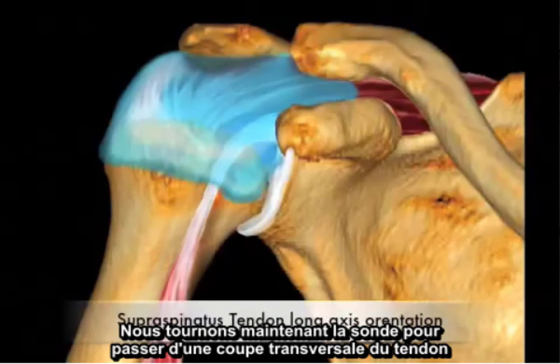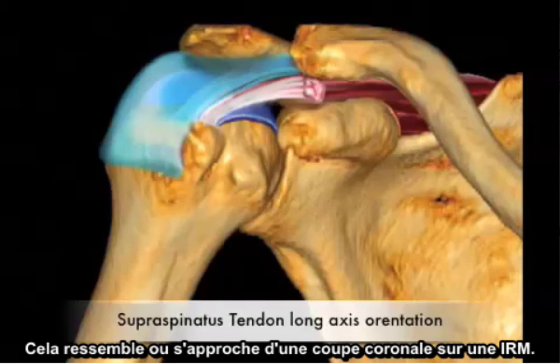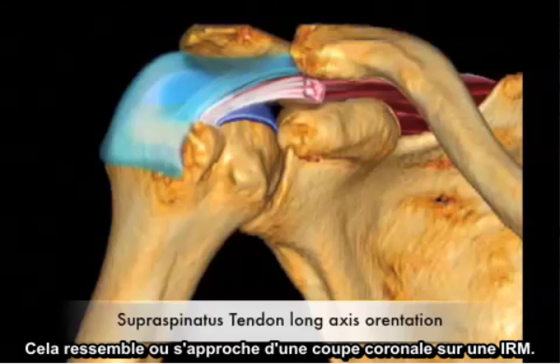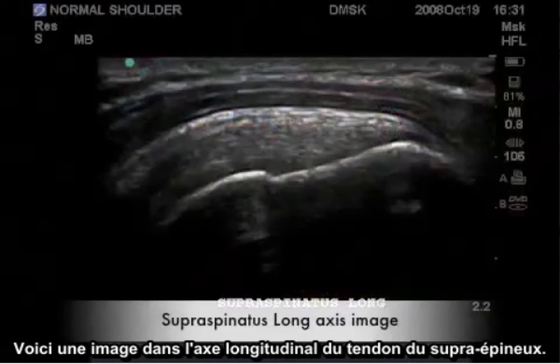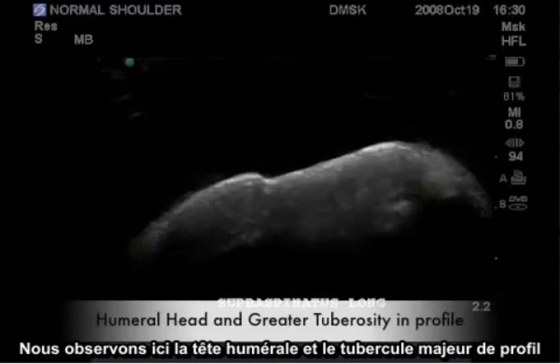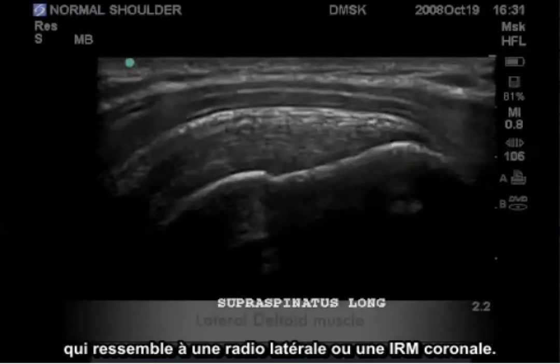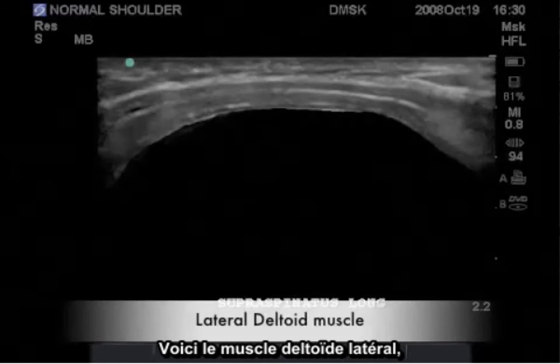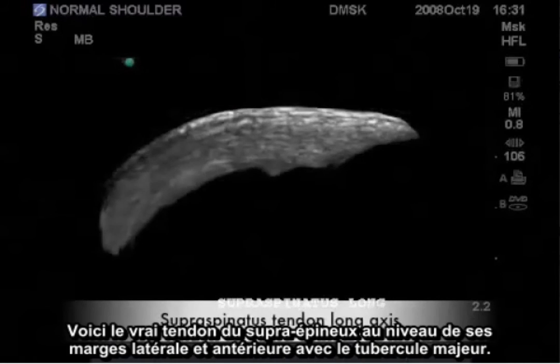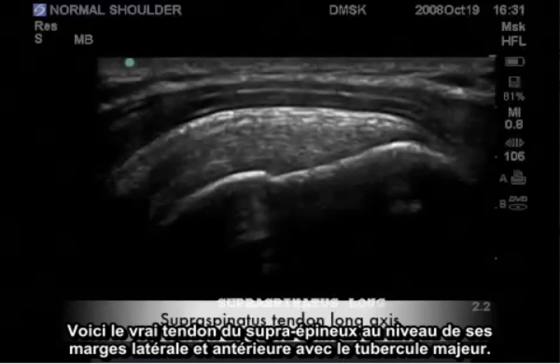We now turn the probe from a transverse slice of the tendon to a longitudinal slice of the tendon, which is similar or comparative to a coronal slice on an MRI. Here is the representative long axis image of the supraspinatus tendon, with the humeral head and greater tuberosity in profile similar to a lateral radiograph or coronal MRI. Here is the true supraspinatus tendon at its lateral to anterior margin of the greater tuberosity.